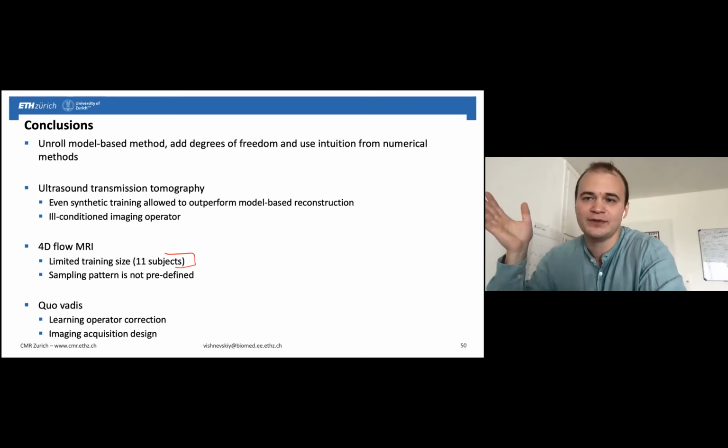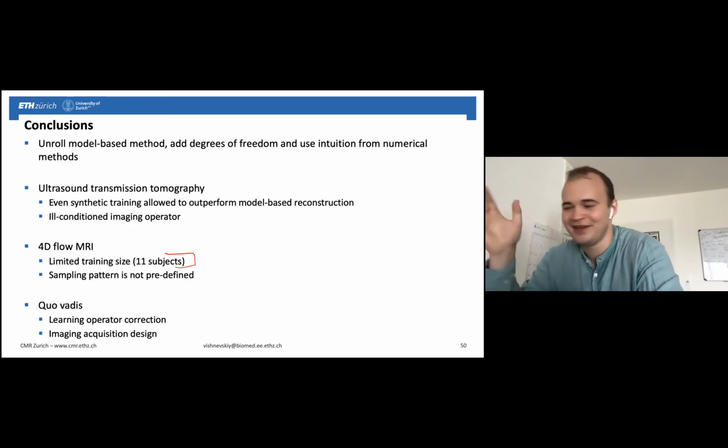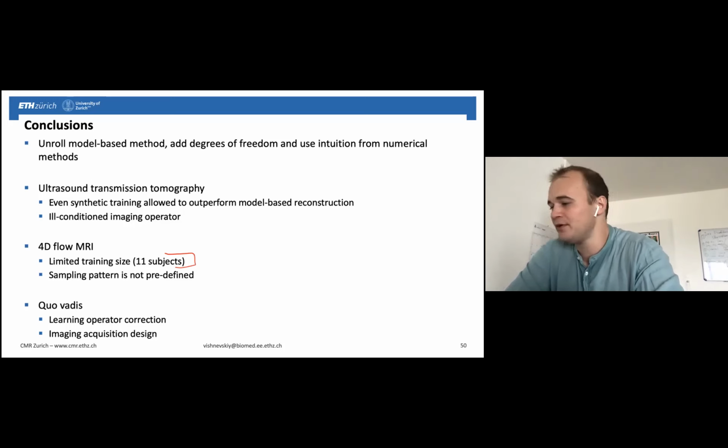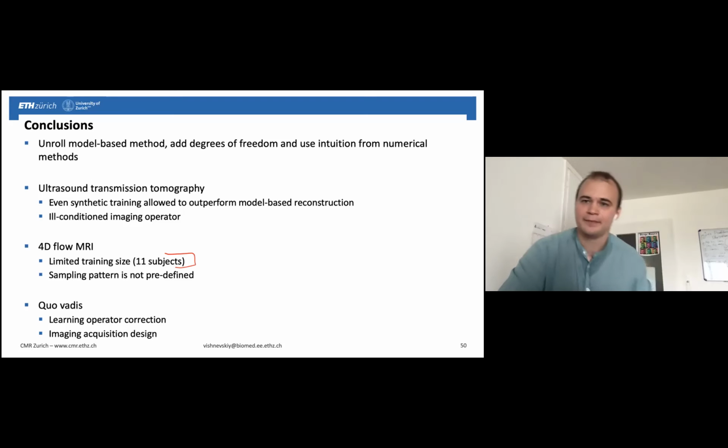So I don't want my variational networks to be too intelligent. I don't want the variational network to understand that it expects to reconstruct a heart, because what happens if, I don't know, there is no heart? That's an extreme example, but you see the point. You don't want to hallucinate. For now, from my perspective, the variational network or the loop unrolling approach theoretically doesn't give you guarantees, as with most things in machine learning, but from my experience it generalizes unbelievably well.